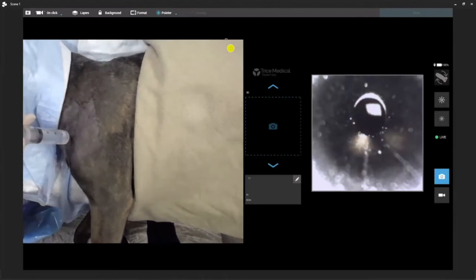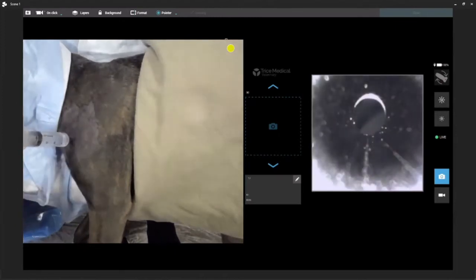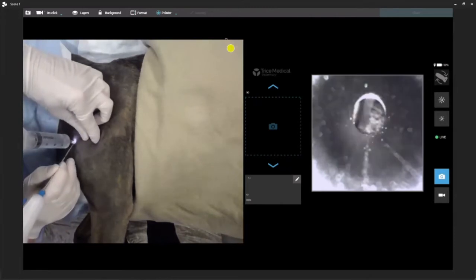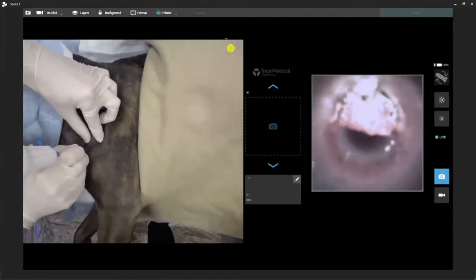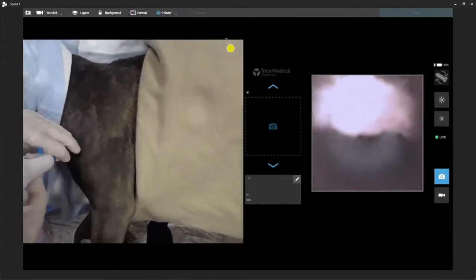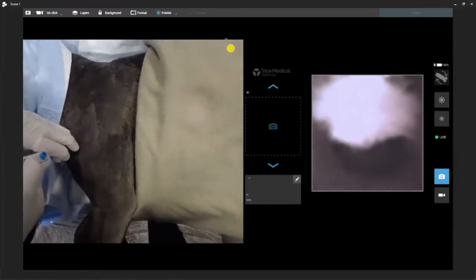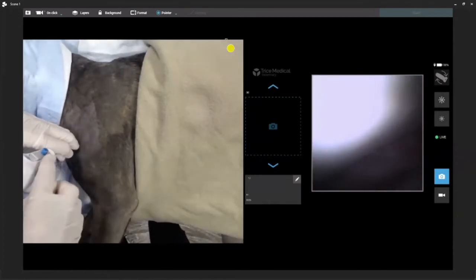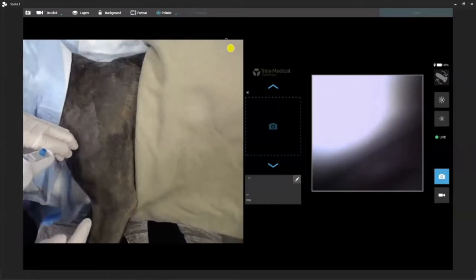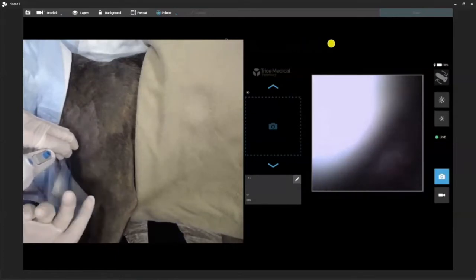I've made my stab. Our optics are retracted, and I'm going to find where my little stab was. We'll count one, two, three — it's going to slide out and I'll slide directly into the joint. What we're going to do next is press in on this handpiece — that allows our optics to go into the joint. They were protected within the sheath. You can see the fluid coming out of the injection port, which tells us also that we are 100% in the joint.